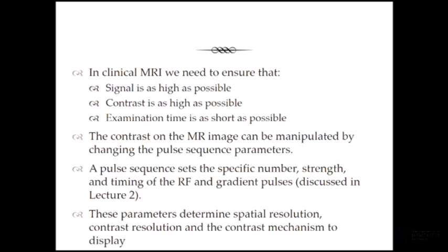We're always under pressure, so what we're doing is making those trade-offs in the development of protocols and adjusting them slightly depending on patient presentation, whether they be someone like a child or maybe someone that you think is going to be a bit of a wriggler. You may just have to make some small changes.